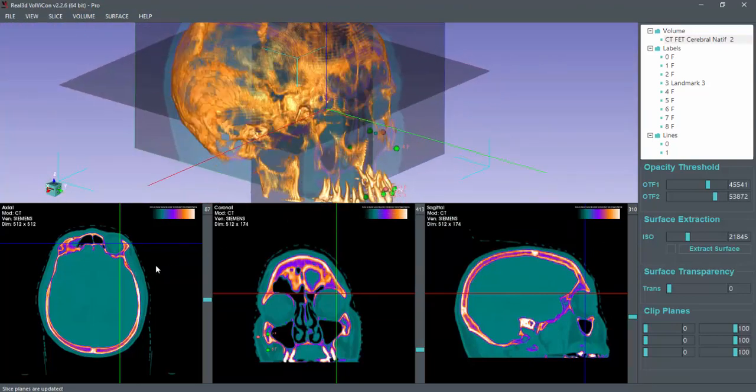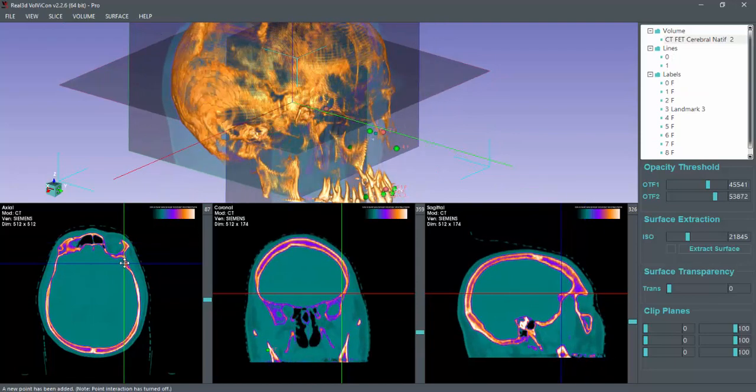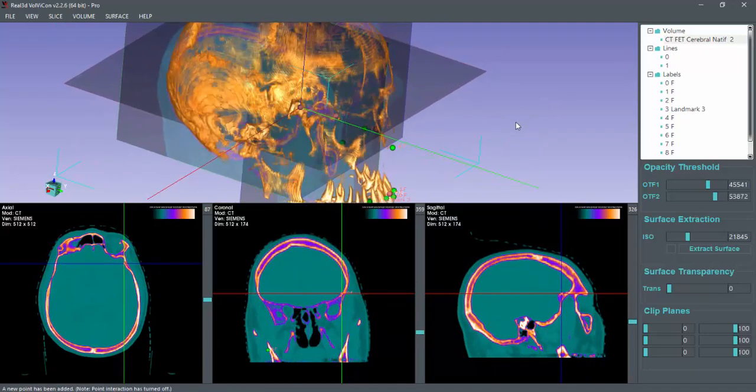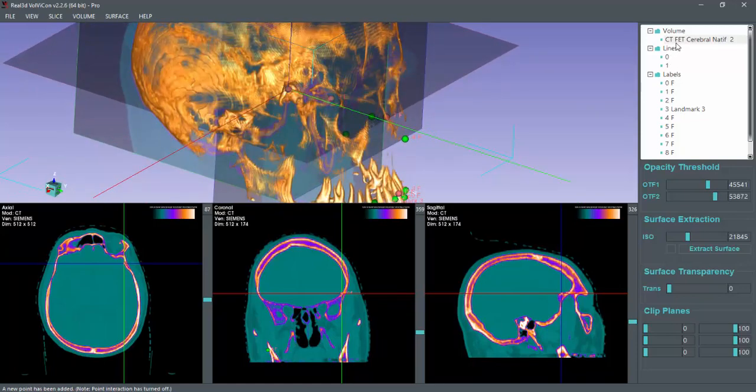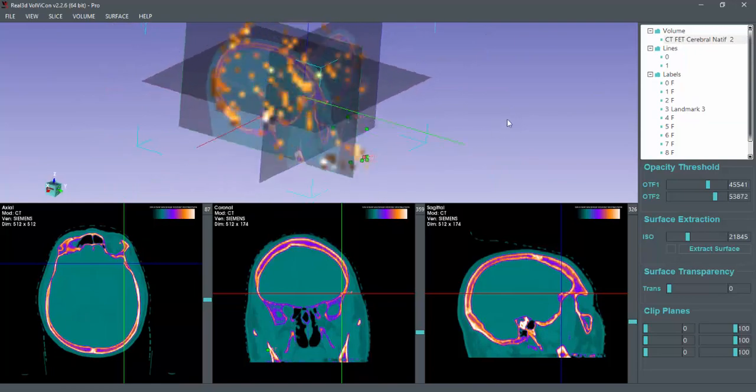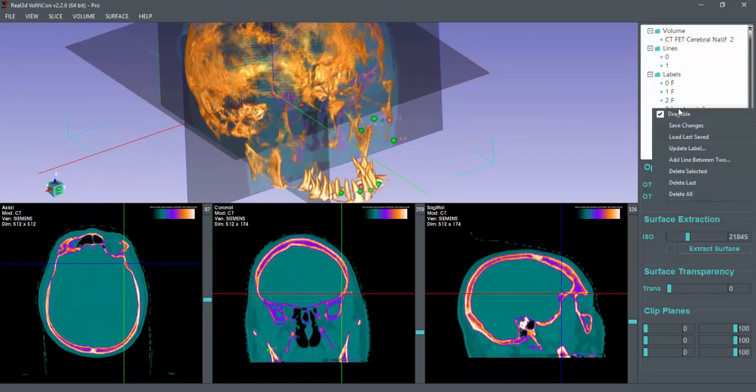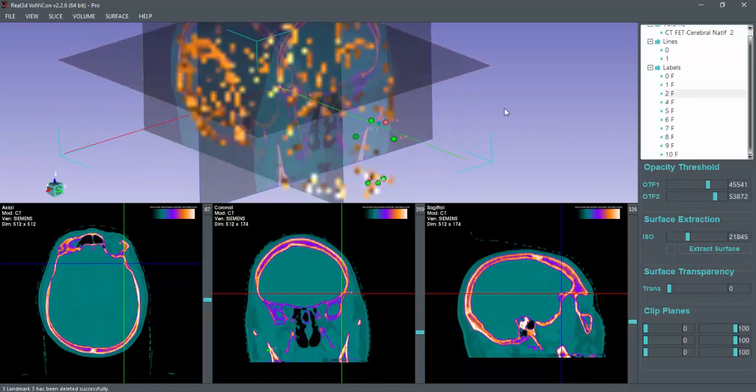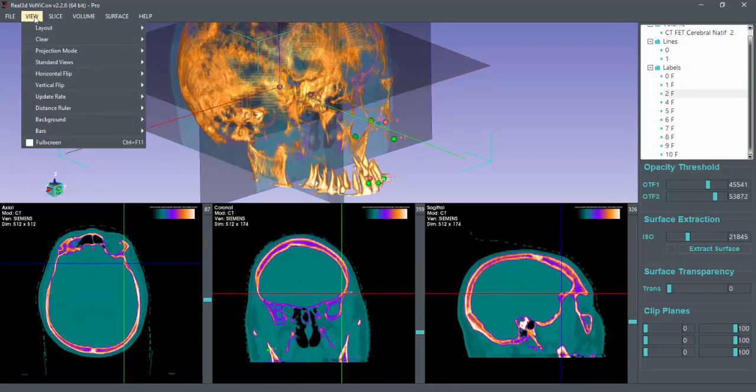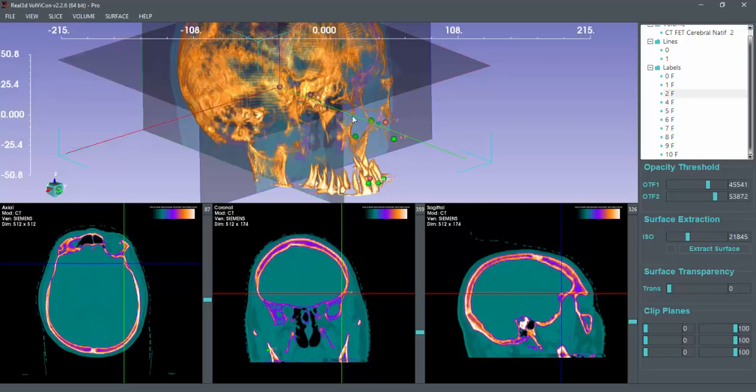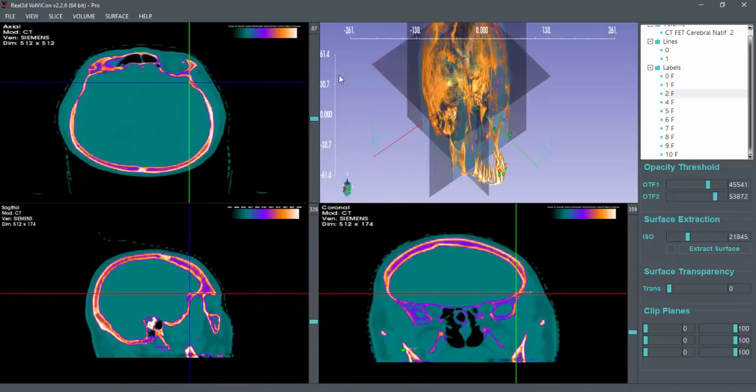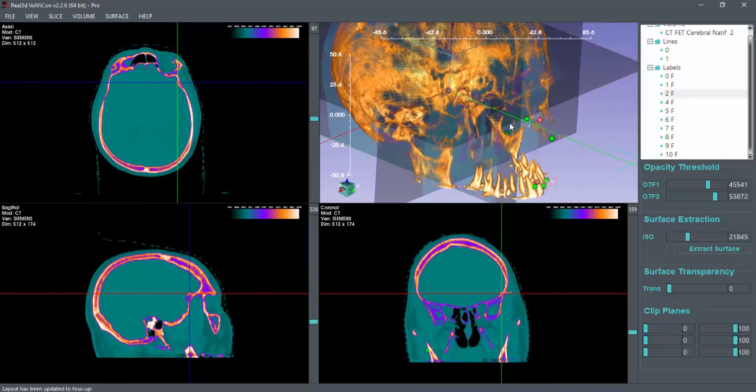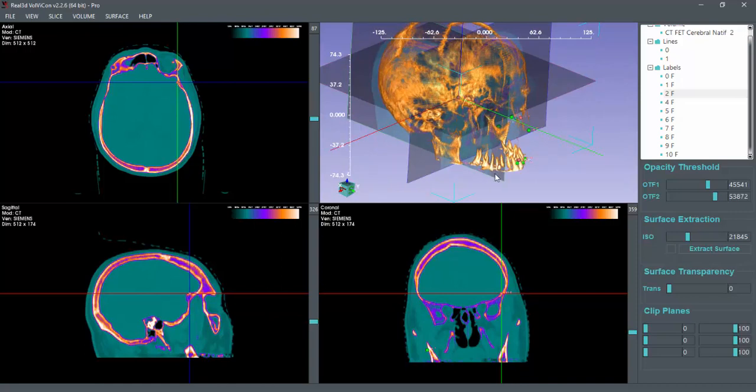And then you can draw new points. You can delete the selected point if you want. You can enable the ruler. You can change the layout. Yeah, that is it. I hope it helped. Thank you very much.